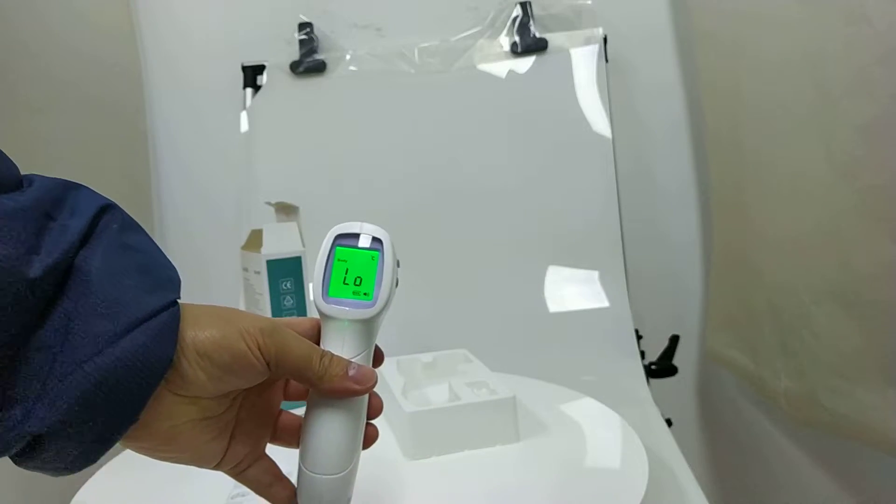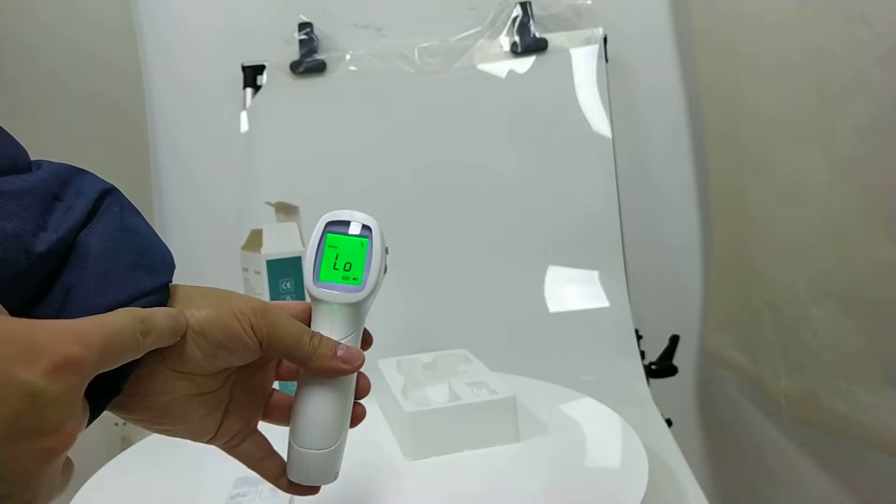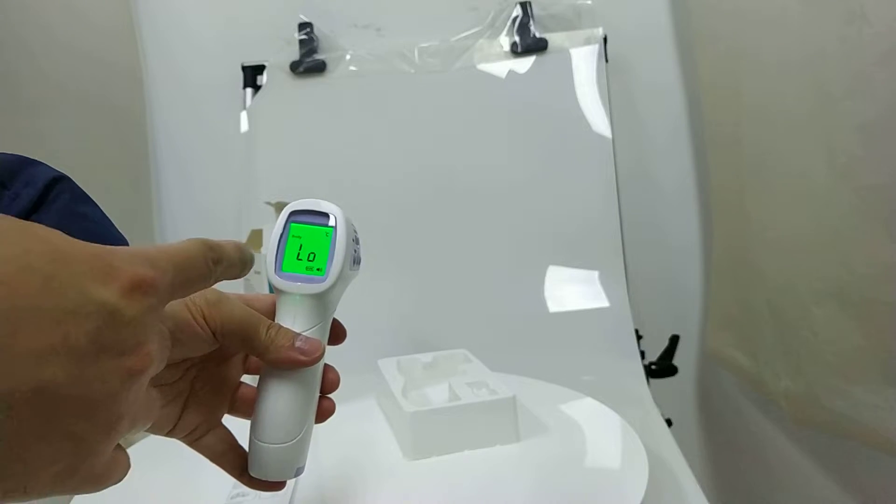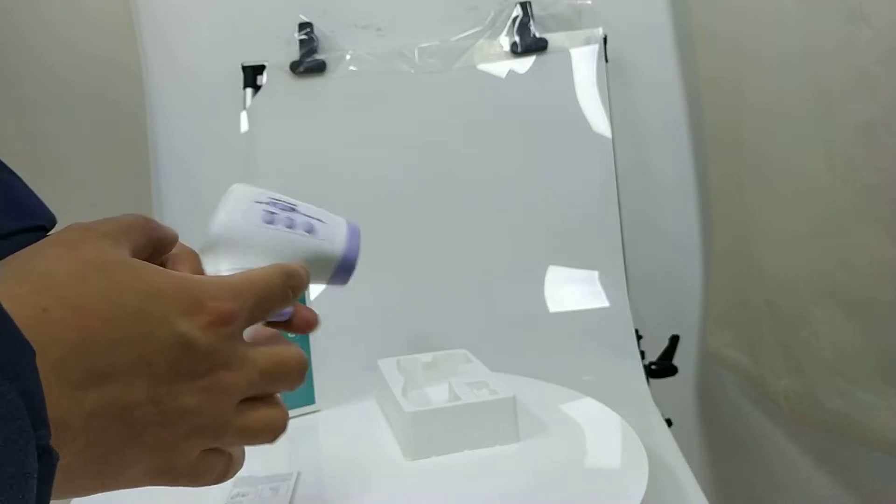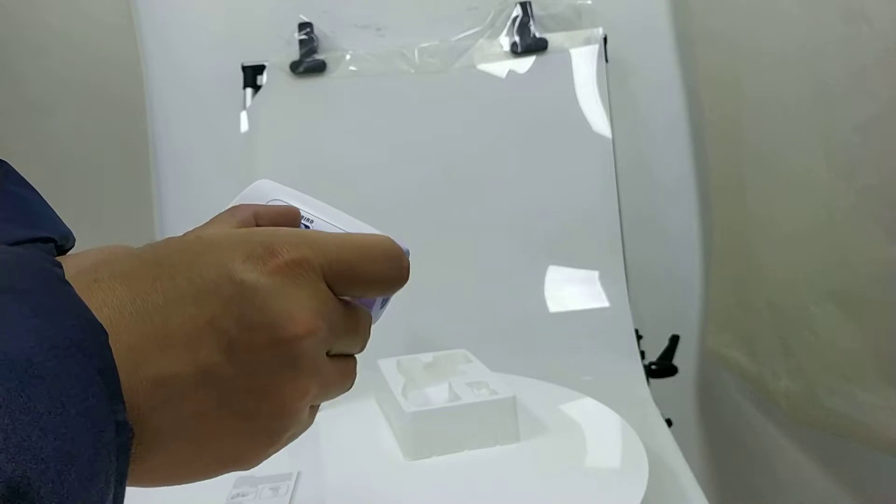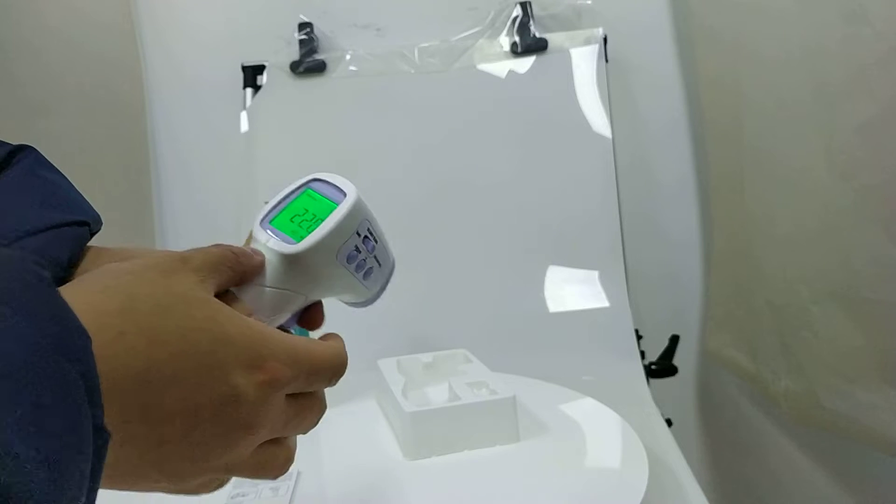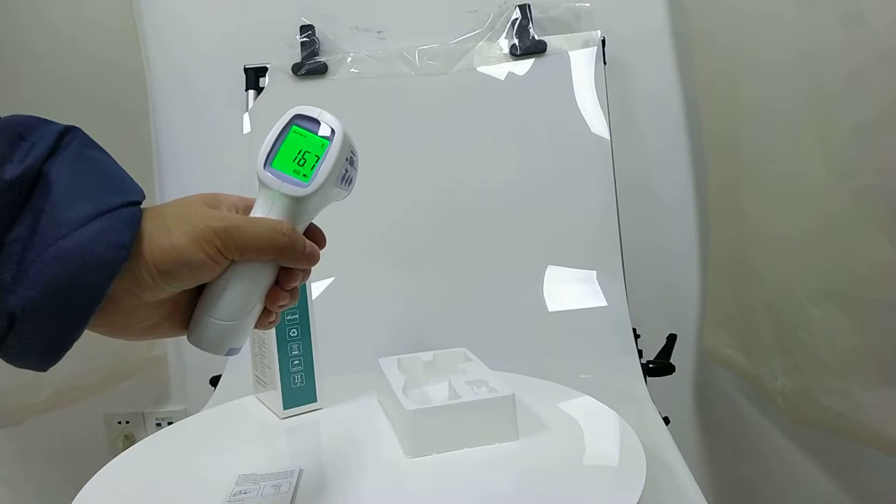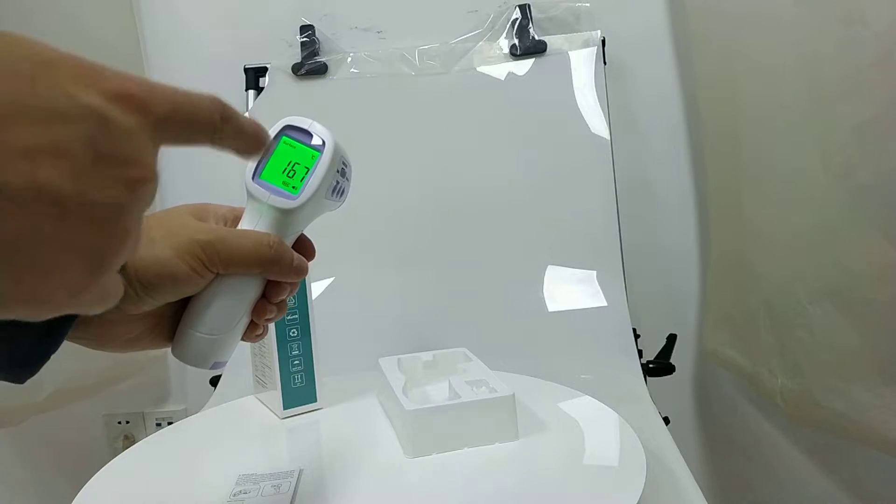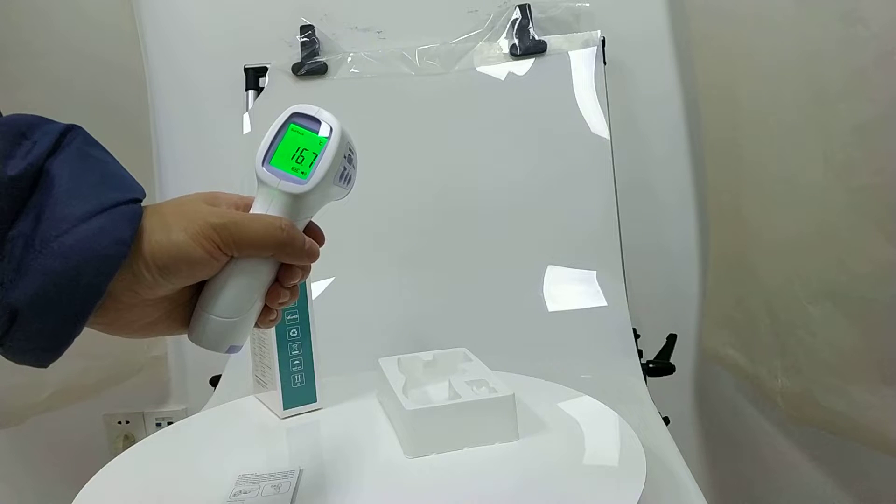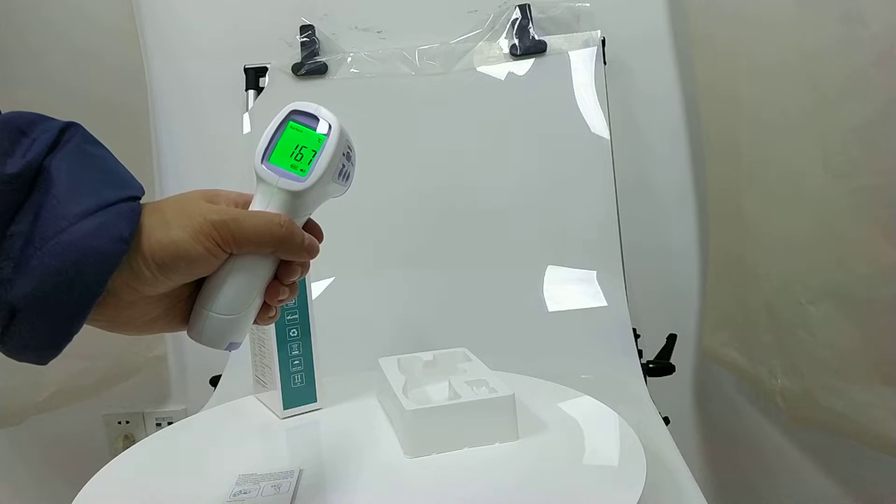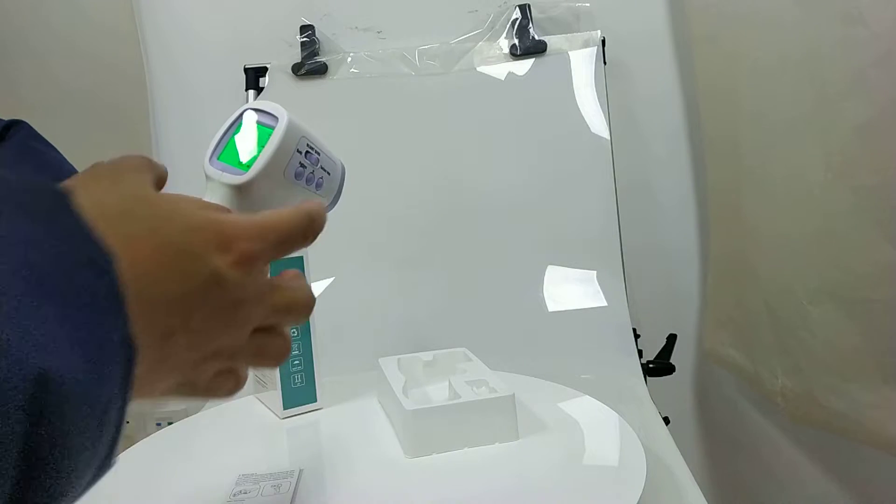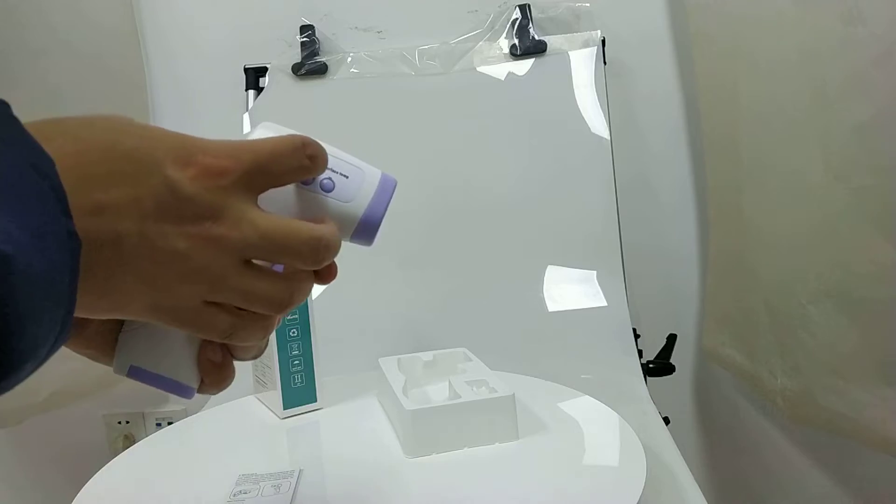This is for body, so it reads low here. If you change it to surface temperature, then you press it again. This is the environmental temperature. And now we come back to the body.